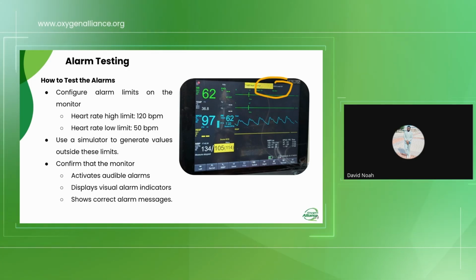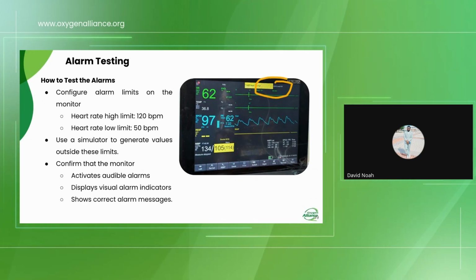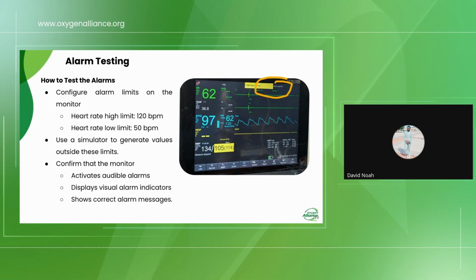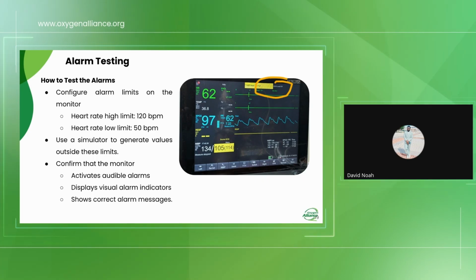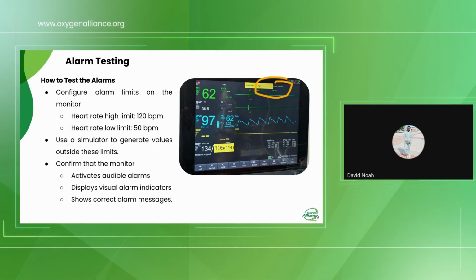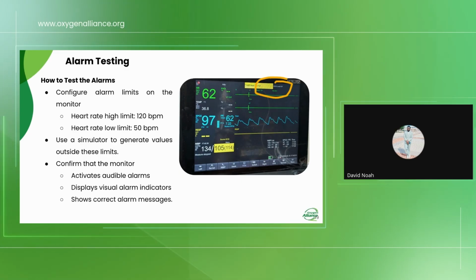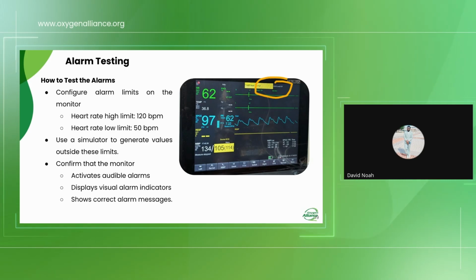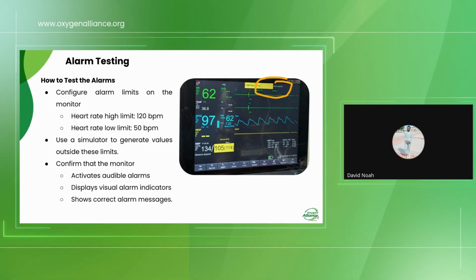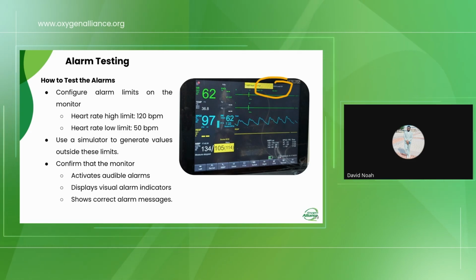You can also generate a value that is greater than 120 beats per minute to check if the monitor will display something like the heart rate is too high, and if there will be an audible alarm. So basically, you confirm that the monitor activates alarms, displays visual alarm indicators, and shows correct alarm messages on the display.